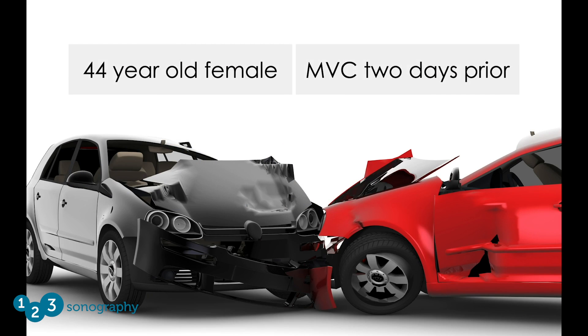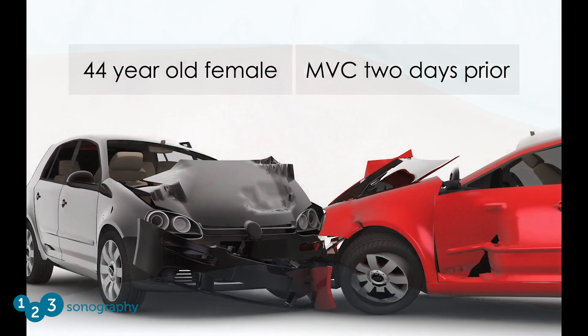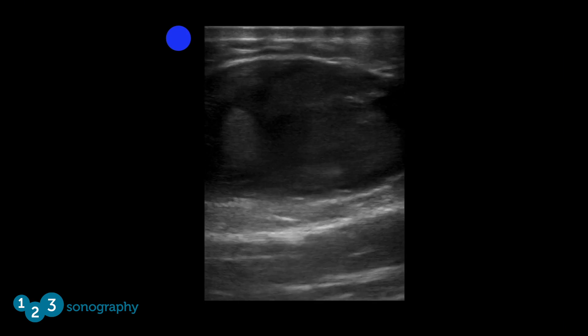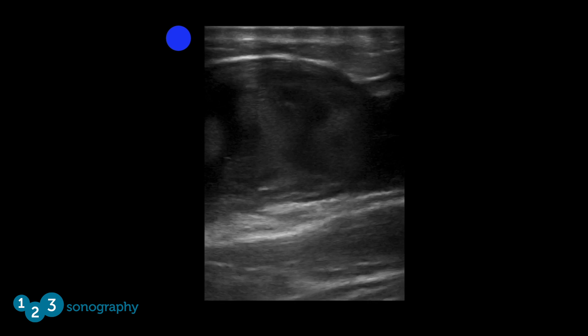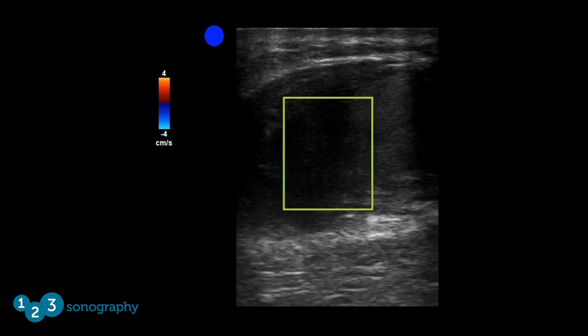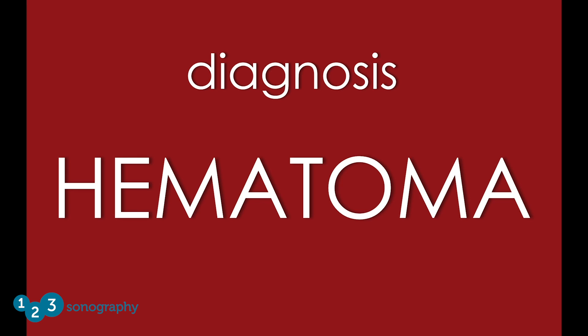Case number four: a 44-year-old female presenting two days after a motor vehicle collision with left thigh tenderness and bruising. Physical exam reveals a large bruise on the anterior thigh with swelling and tenderness; x-ray of the femur and knee are unremarkable. Bedside ultrasound demonstrates a heterogeneous fluid-filled structure over the point of maximal tenderness and ecchymosis. When color Doppler is applied, there is no evidence of blood flow. The diagnosis is hematoma — although the ultrasound image looks a lot like an abscess, the history and exam are consistent with hematoma from recent trauma, and the lack of blood flow on Doppler is a useful distinguishing feature.